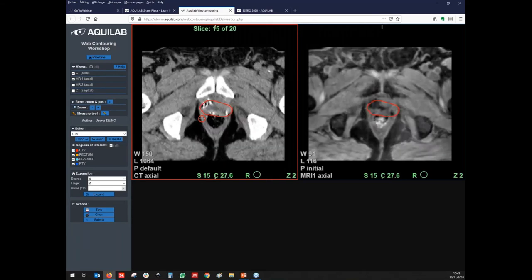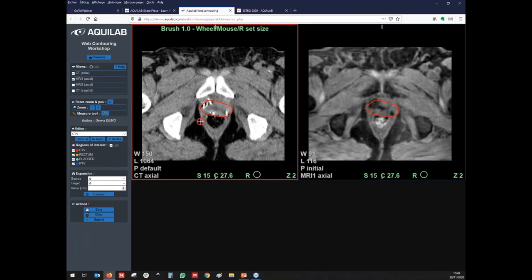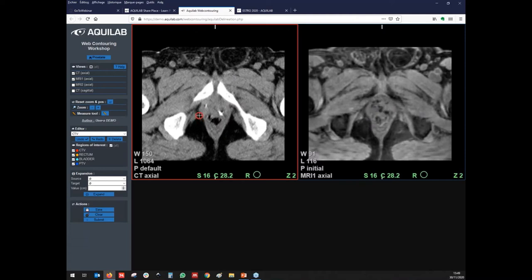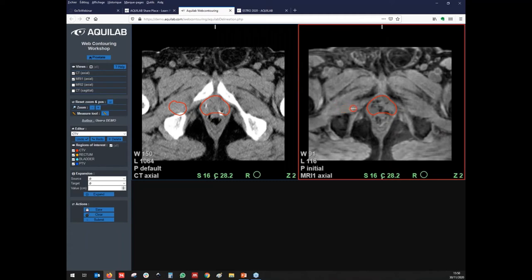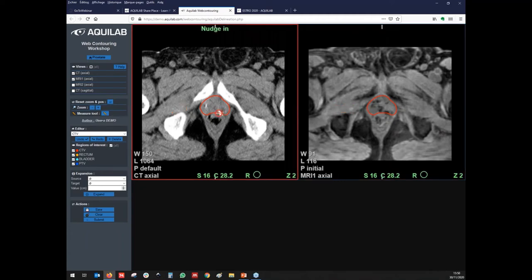I can easily change the slices. You can see the brush you can use to contour, and here you can modify the brush size. I'm not a doctor, so sorry about that. You can add contours very simply to make the contouring easy. You can also make modifications on the MRI if you want. When the brush is green, that means you can add part of the contour. If you are just outside, you can remove part of the contouring. And if you are really far away, you can create a new one. It's very easy to modify or add a contour, and you can do that on multiple views.